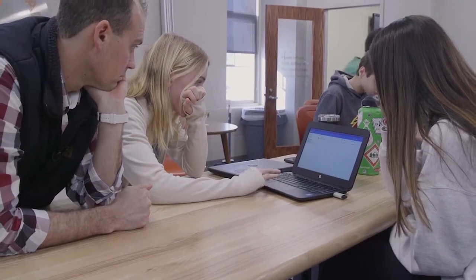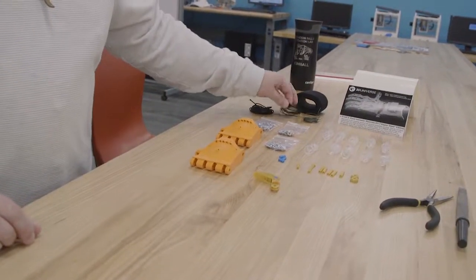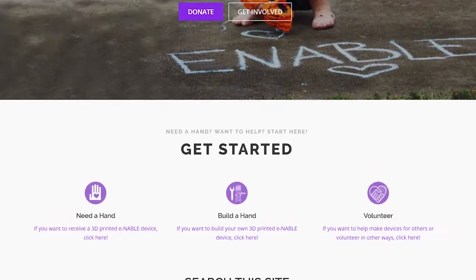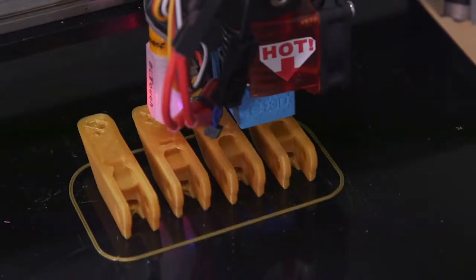It's really interesting how we can create a prosthetic hand. You would never think of a traditional 8th grader to be able to do something like that. These parts will eventually become the prototype of a mechanical hand for a volunteer community called Enable, which distributes hands to people in need across the globe.